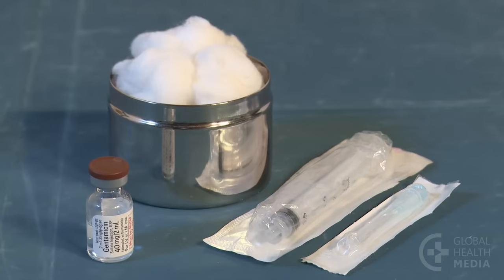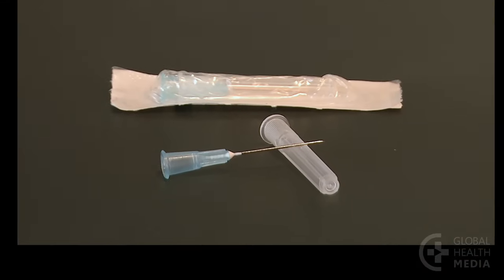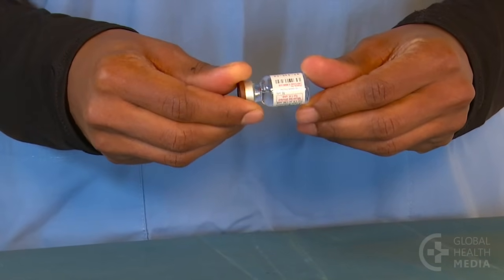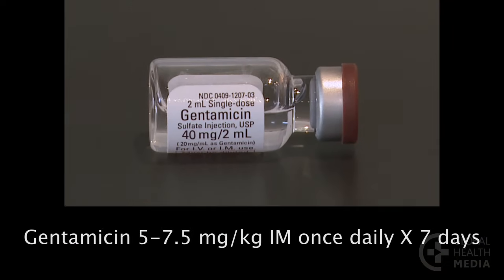Then gather a vial of gentamicin, a sterile needle and syringe, and some cotton balls. Use a small syringe between one and three milliliters to accurately measure the dose. The needle should be narrow — 23 to 25 gauge — and long enough to reach the baby's muscle, five-eighths to one inch long.